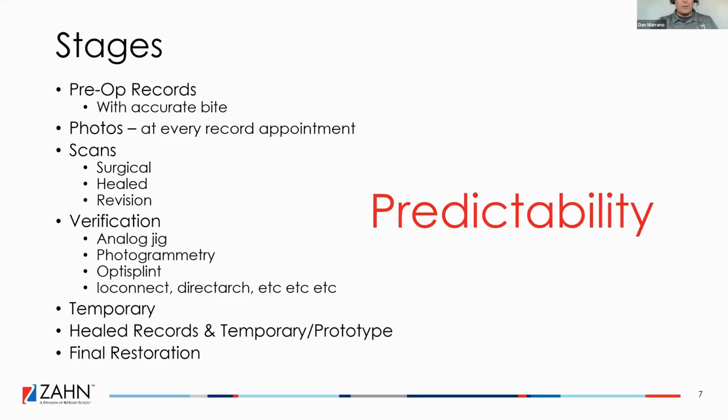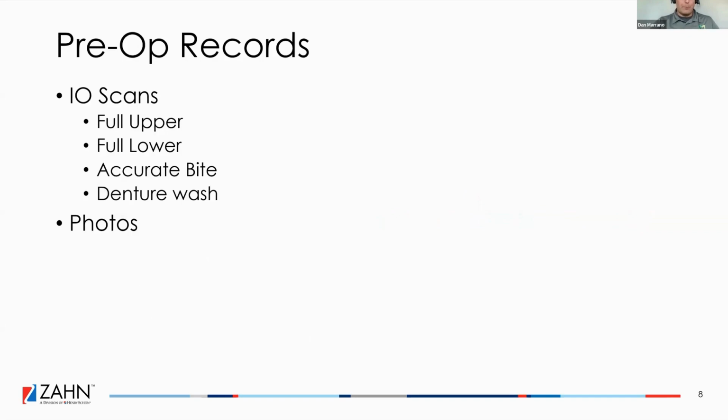What all this gives you when you put it into the digital environment is predictability. I've had many doctors come from analog to digital and tell me it was a much smoother workflow. Everything fits so much nicer, and they really appreciate what we do on the back end when they go to see it.